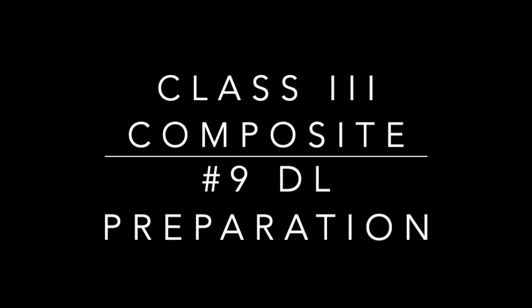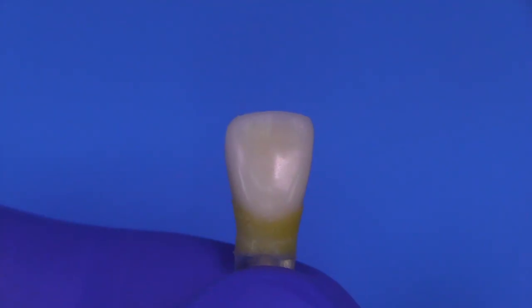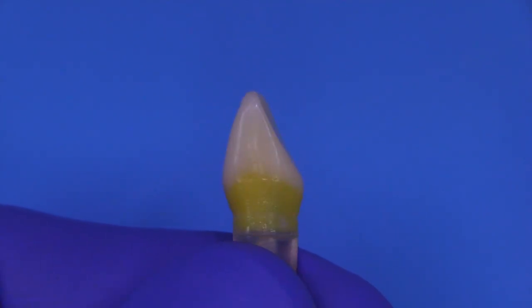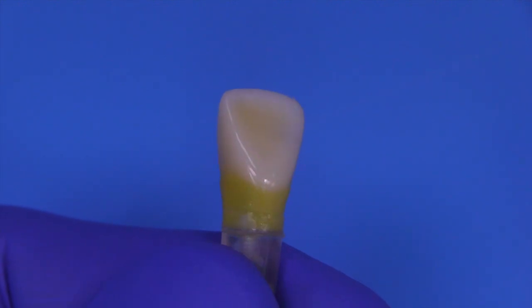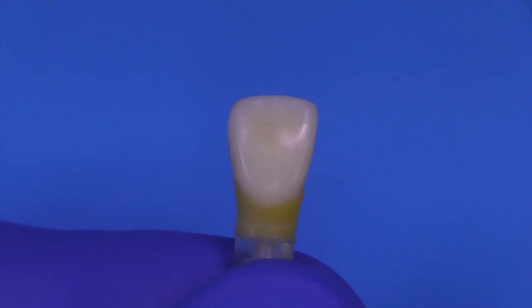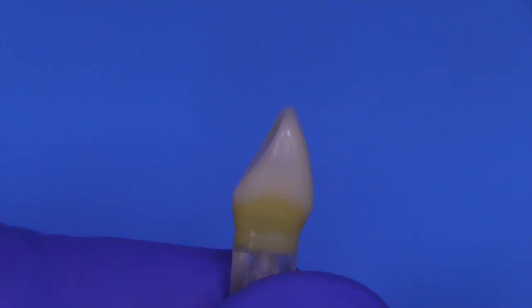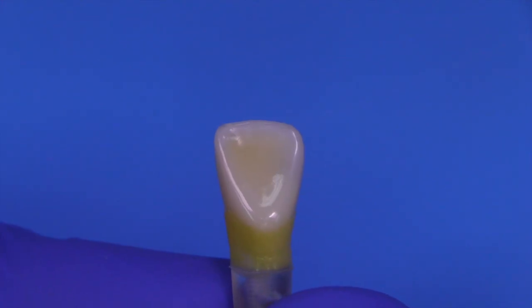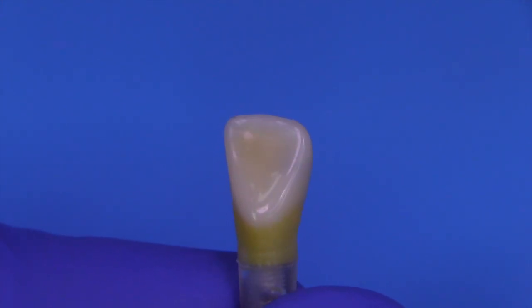Today we're going to cover the class three composite number nine cavity preparation. This is an accidental prototype that looks a lot like the Compident tooth featured in examinations for dental students wanting to become dentists and get licensed. It is not the actual tooth — this is a prototype, and I want to warn you that it's not something you can even purchase anywhere.